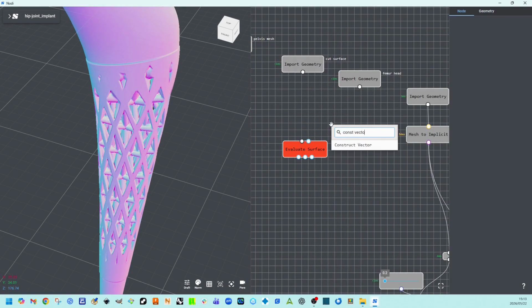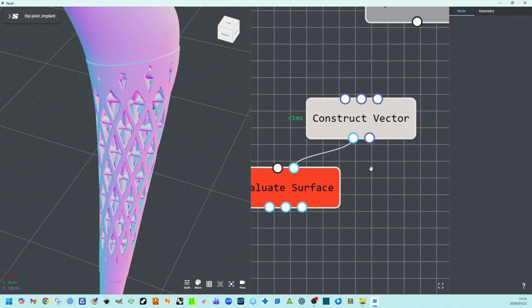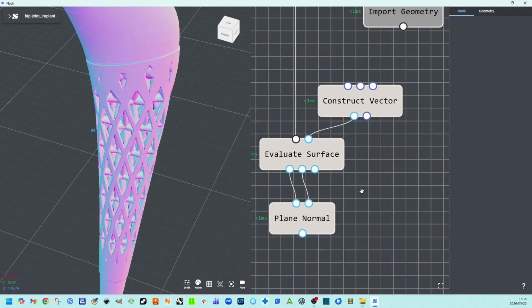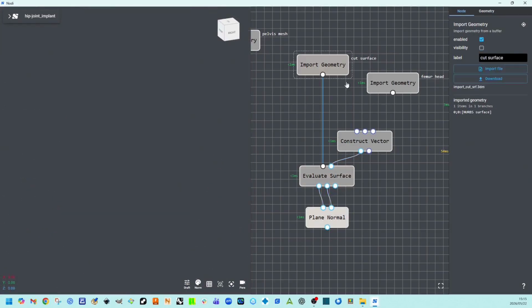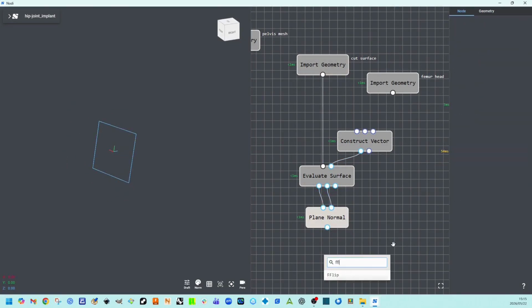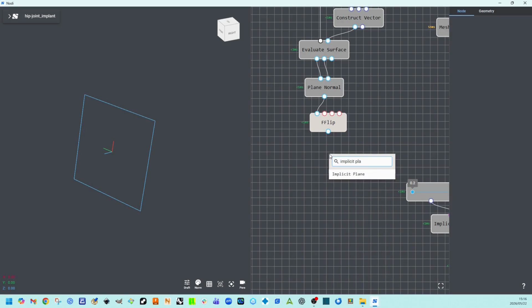To set up the femoral head, we use construct vector for the sample location, feed it into evaluate surface on the cut surface, and read back the point and its normal. To build the cut where the ball meets the stem, we pass that through plane normal, Flip, and implicit plane.